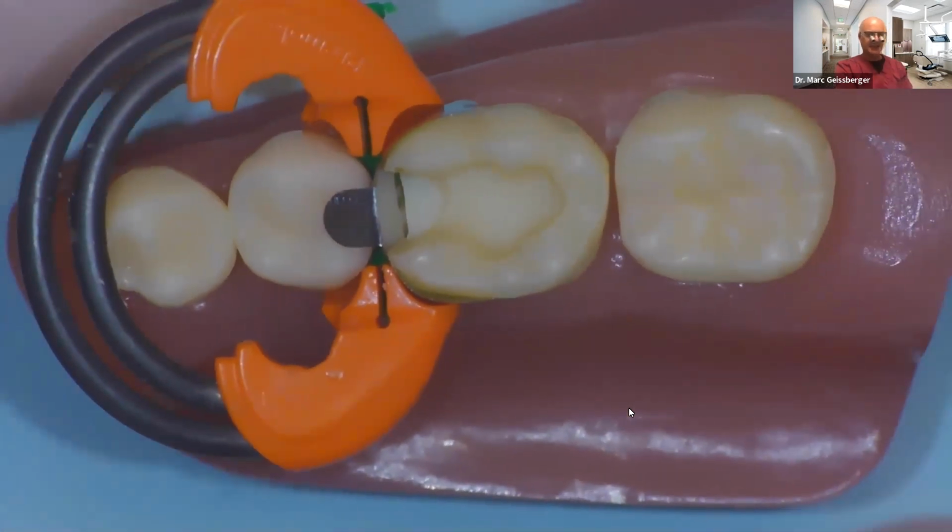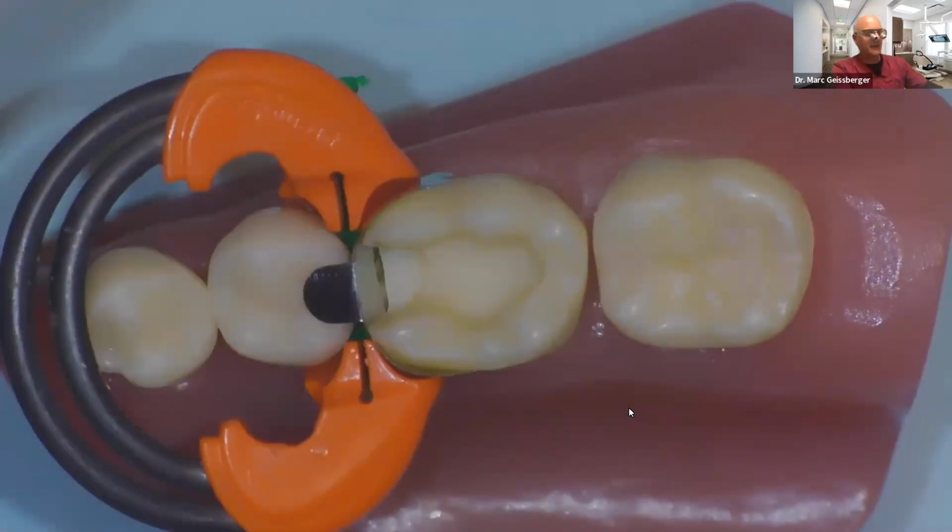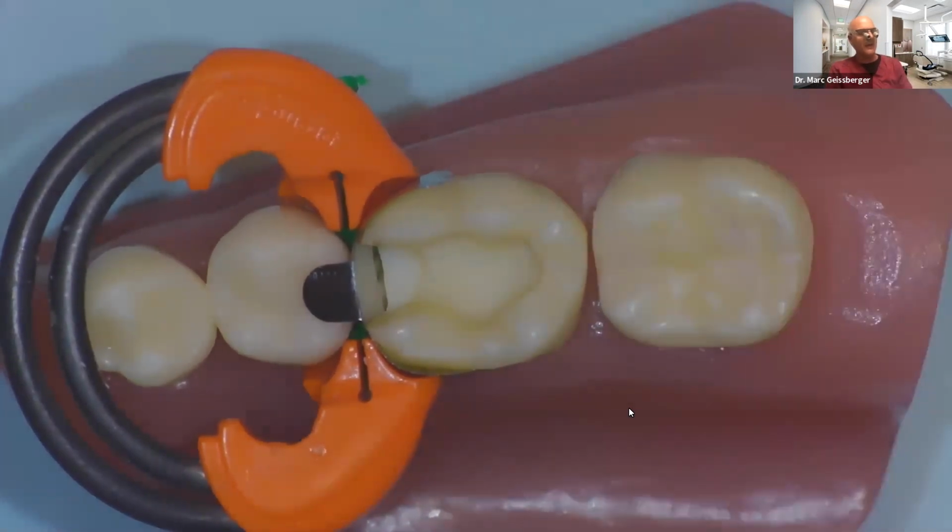Okay, next thing is to place my adhesive. Now, because I'm in my office and I'm not right by the sink, I don't have the ability to rinse everything off. So I'm going to omit the etching and go right to my adhesive placement.